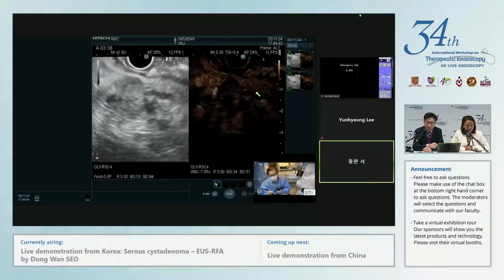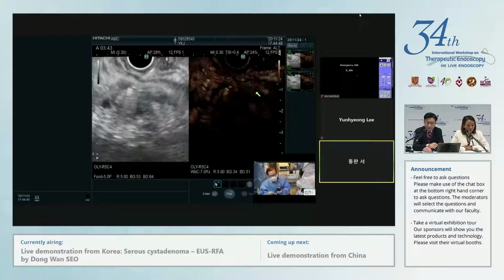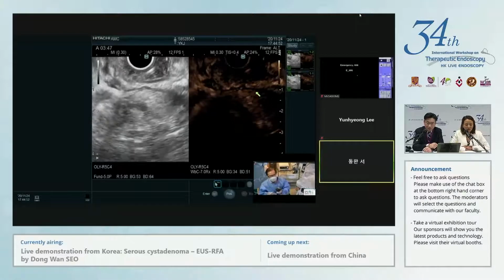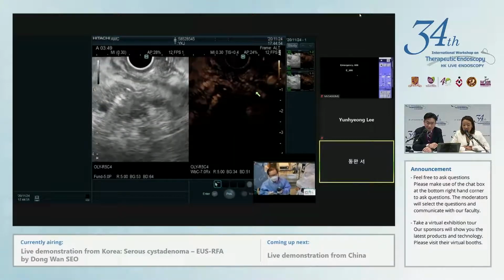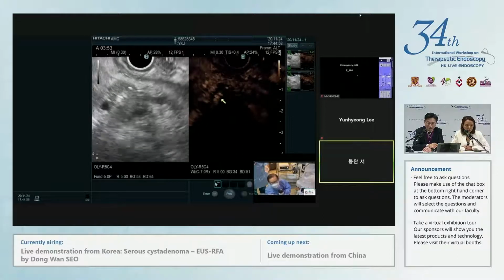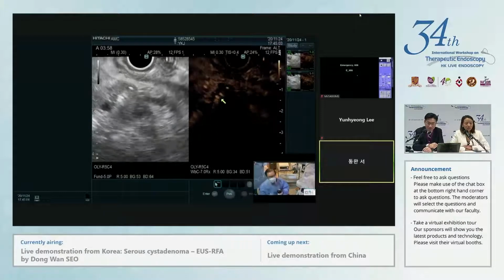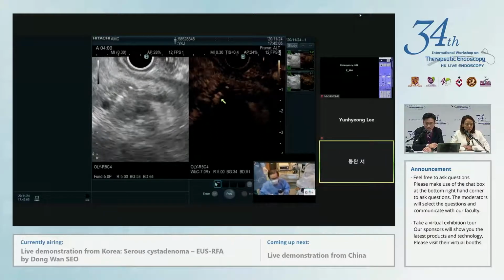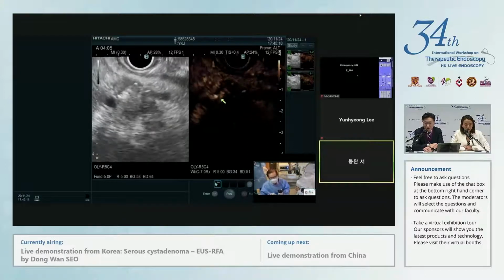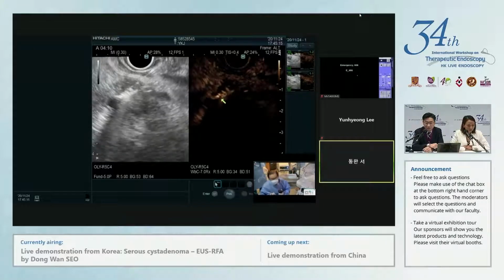I think my electrode is now outside, and I am puncturing the viable part. Can you see it? Very nice electrode check. Yeah, this is the electrode. So I'm going to apply power here under direct EUS view. I applied the power, then I think I can see. But this area is already an ablated area, sorry. I think I need to stop here.